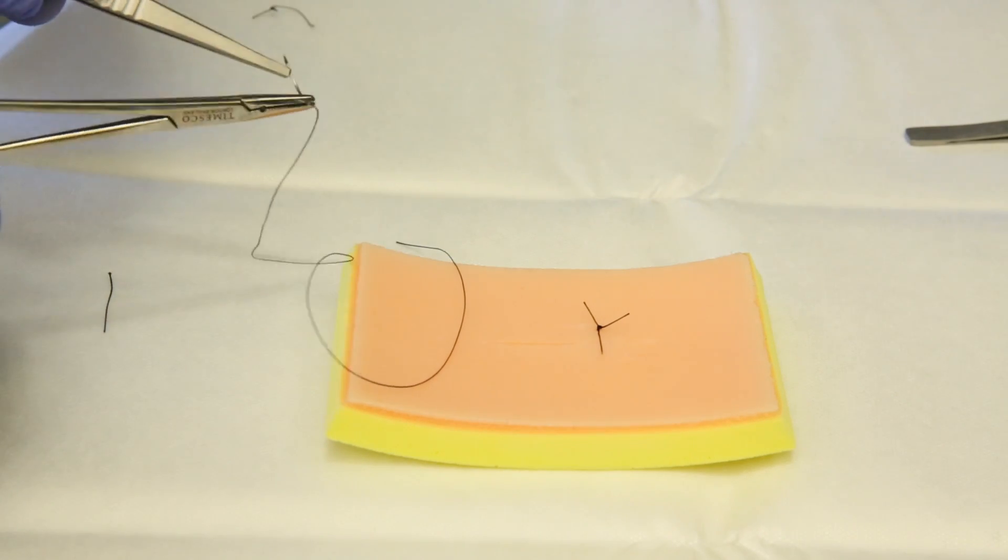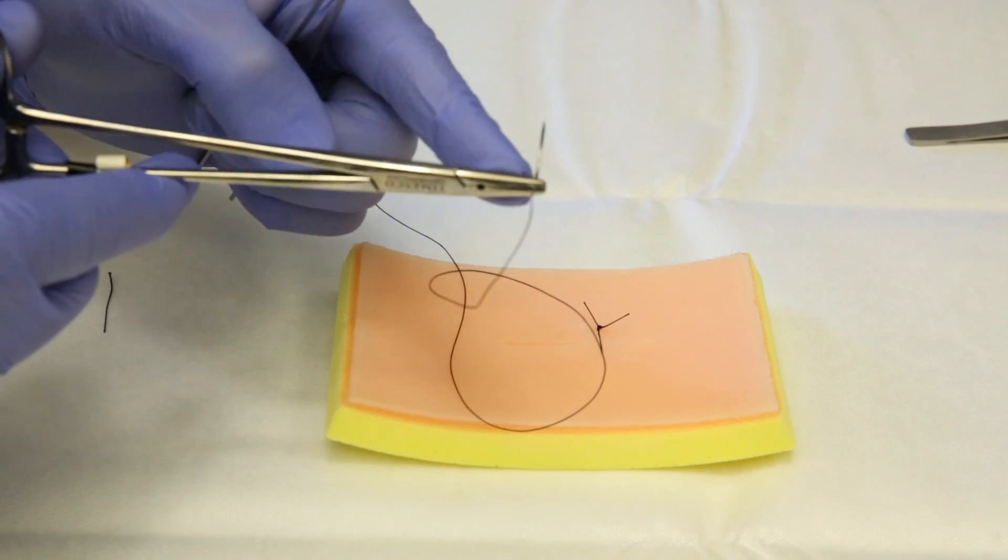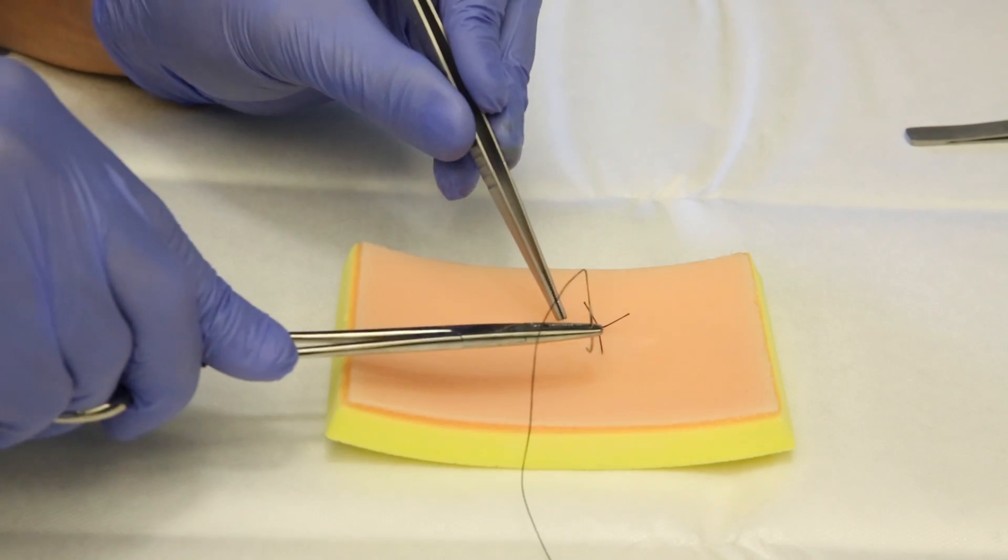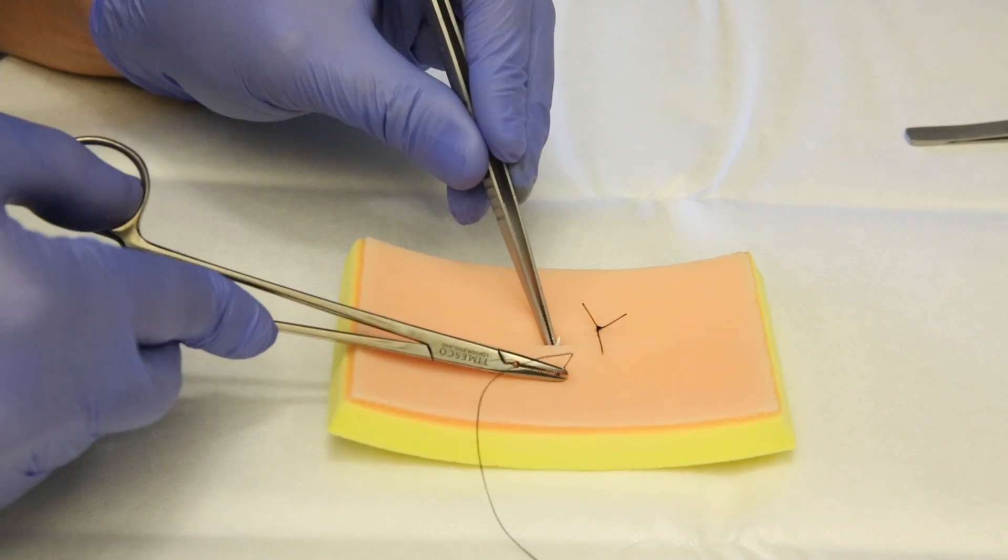First, take the needle, right position, at the tip of the needle holder, about a quarter or third from the back of the needle. Again, going through the wound margin, starting from the right side, if you are right-handed.